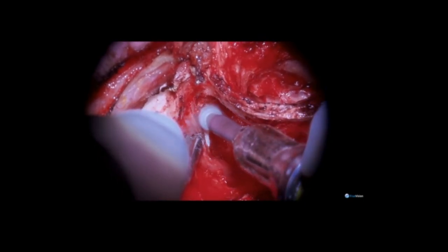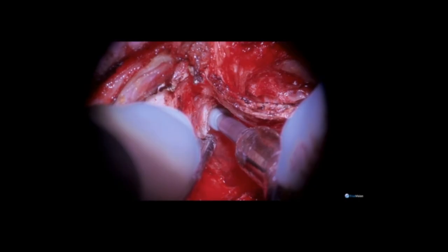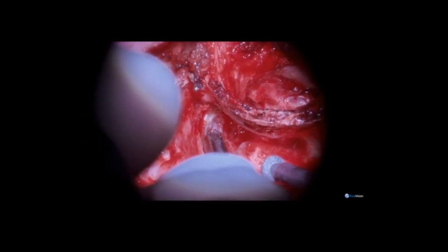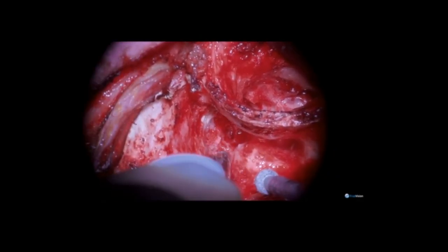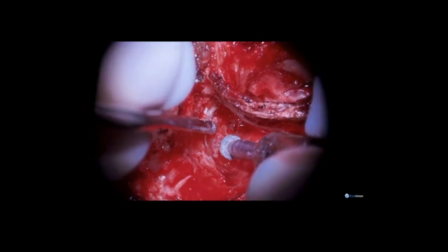Using a diamond burr, I will take down the petrosquamous stalactite and then explore the sinodural angle, because these are two major regions of recurrence from hidden cholesteatoma that can trap underneath unvisualized regions.